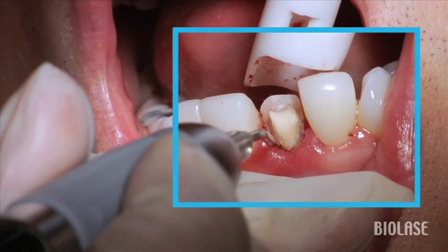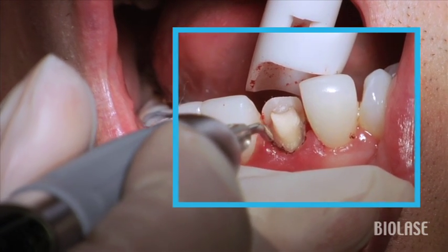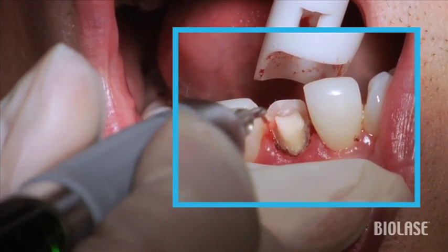After the tissue has been removed, I'm actually troughing in here so that we're able to get a nice impression. And then we're going to end up re-cementing the patient's dislodged veneer temporarily until we get the new prosthetic back from the lab.